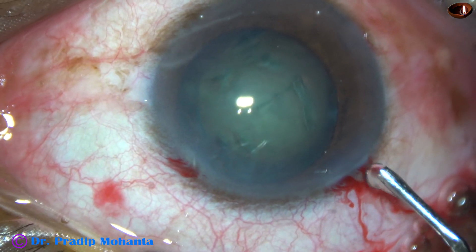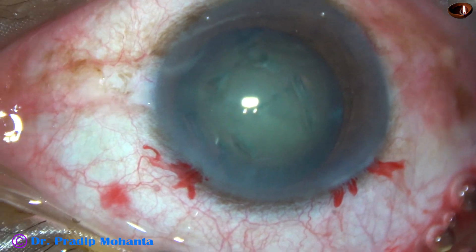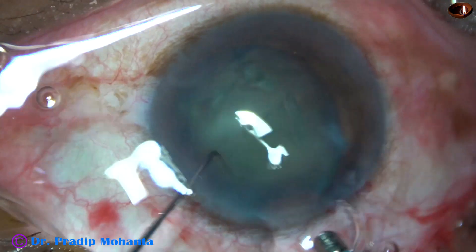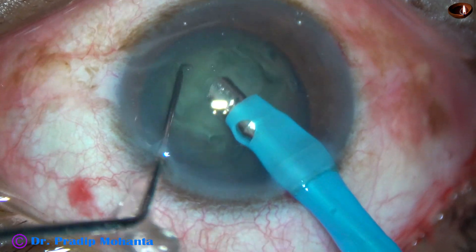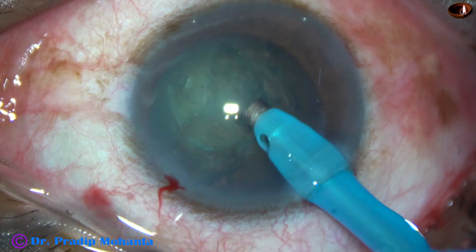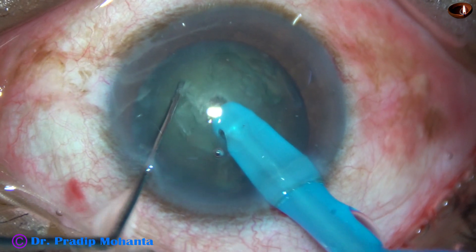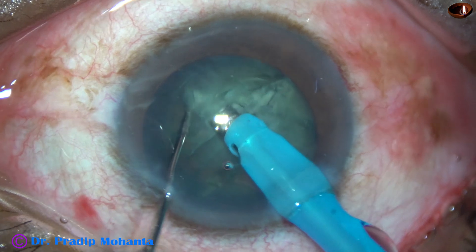And now the anterior chamber is again filled up with viscoelastic. Now is the time to introduce the tip of the needle. The machine being used is Oertli Faros. And here goes the tip of the FECO needle. The FECO needle is buried into the substance of the nucleus and it is chopped — this is what you can call vertical chop.